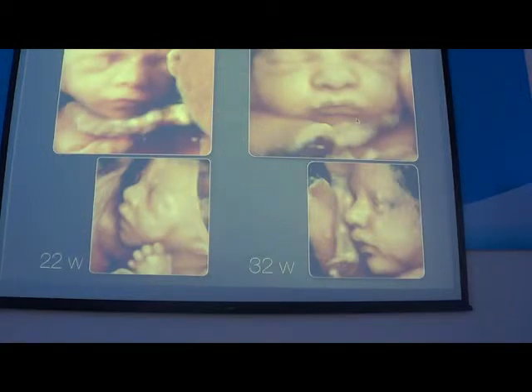And this is a normal aspect at 32 weeks. The baby is fatter and we can clearly see the eyelids.